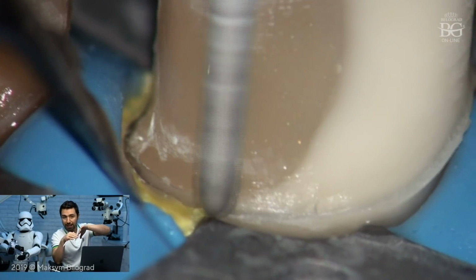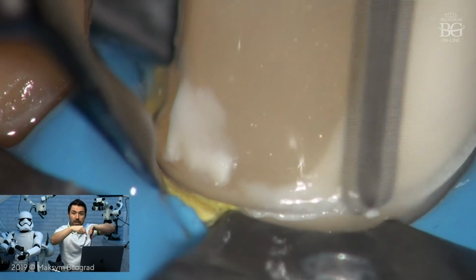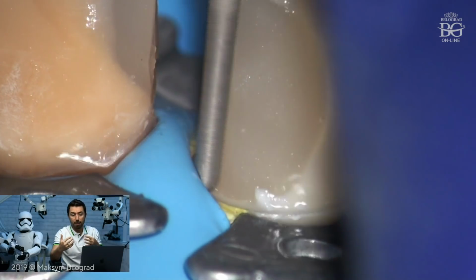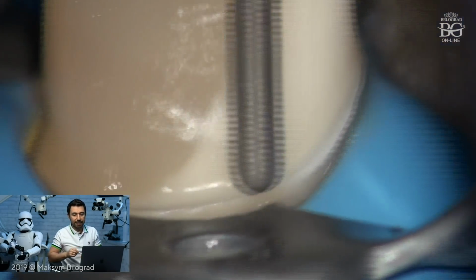So first of all, you can see that I was using a flat plastic metal instrument. I retracted the rubber dam, and I was doing this preparation in the presence of the flat plastic instrument. Then I noticed that in areas where my bur was interacting with the rubber dam, nothing happened. So I just removed the flat plastic instrument, and I continued preparing the tooth with my bur without it.